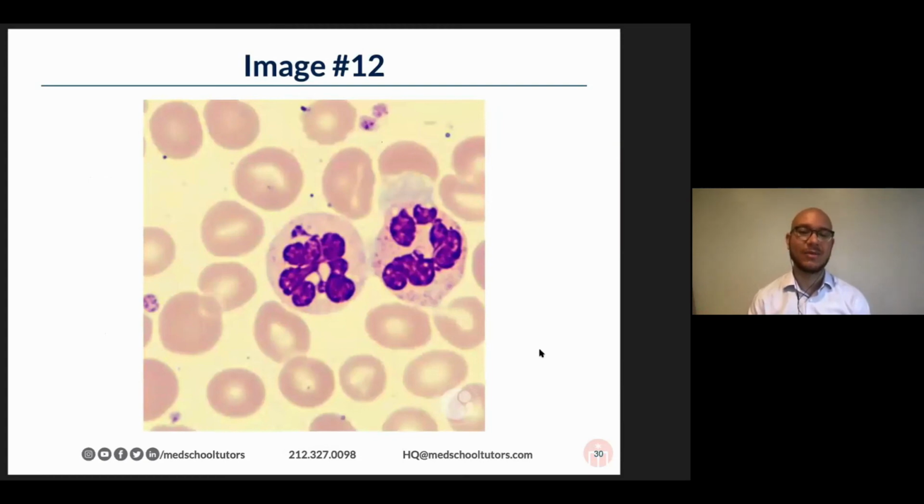Next, we're nearing the end here, friends. And here, this is something subtle. This is something a trained pathologist would be looking for. The morphology of these neutrophils. And I know folks have been waiting for this one. I've seen this answer a couple of times in the chat already as I'm glancing at you all. And you're absolutely right. These are hypersegmented.